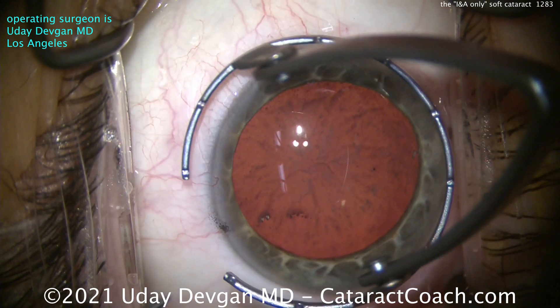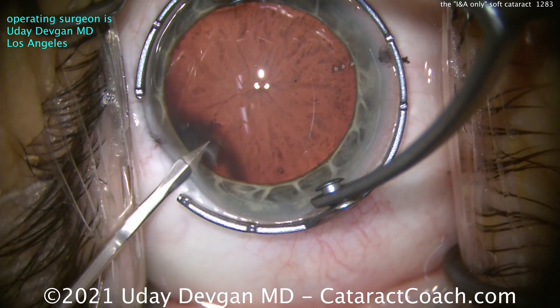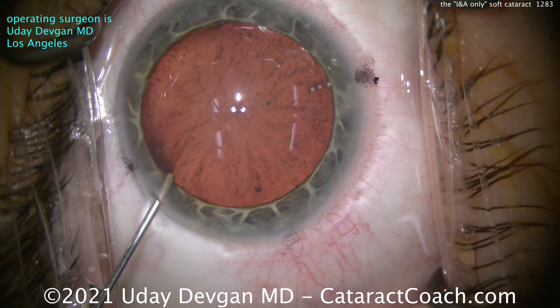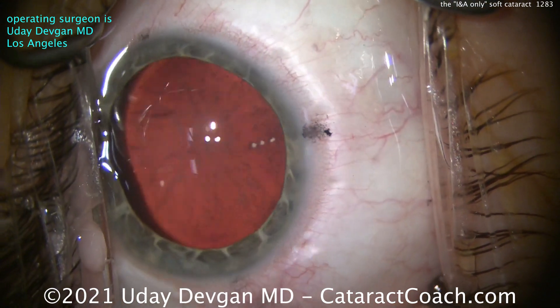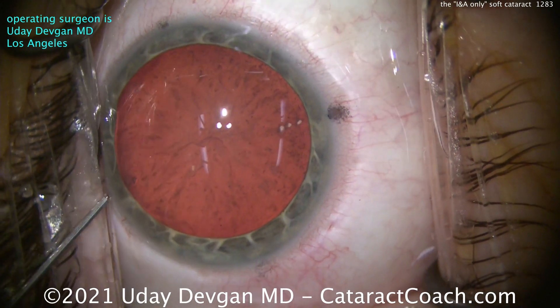This is a complete cataract case shown start to finish of a young patient who's 30 years old. And there's our first incision here. The patient was about a minus 4 myope in both eyes.